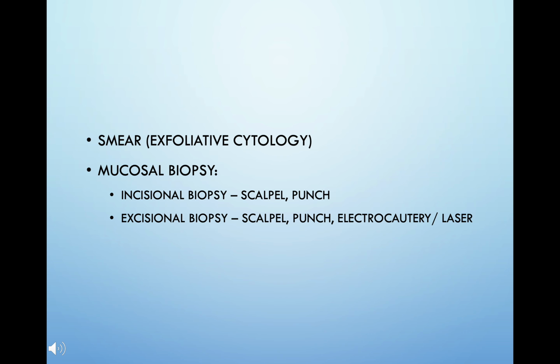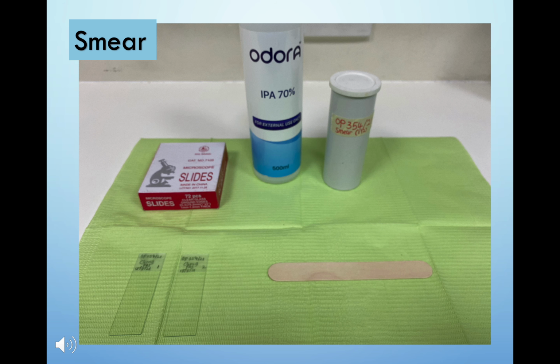Then for mucosal biopsy, we have incisional biopsy and excisional biopsy. The instruments that are commonly used include scalpel, a punch, or electrocautery or laser. Sometimes we do smear to rule out candidal infection.